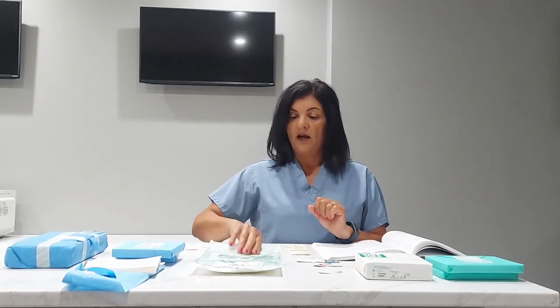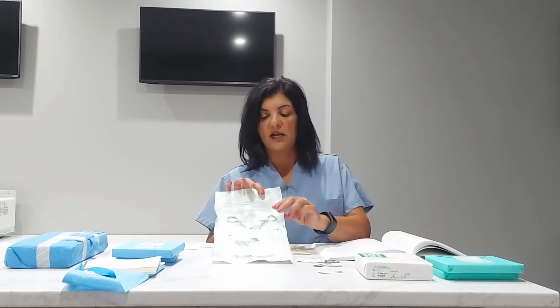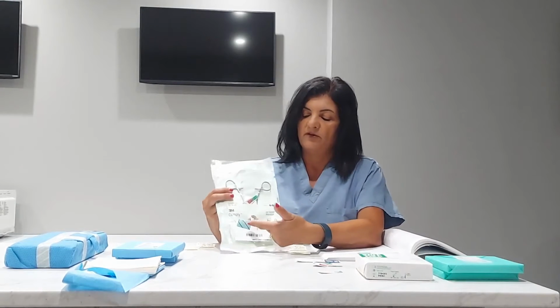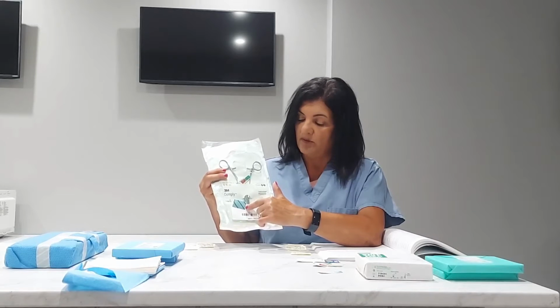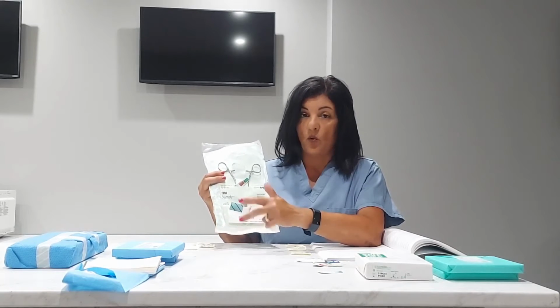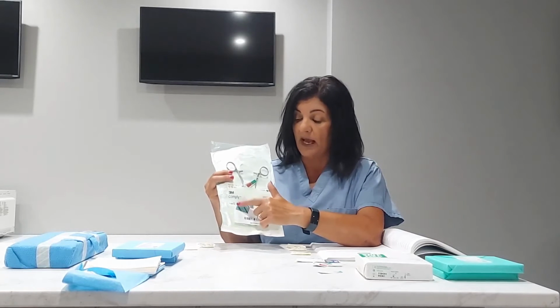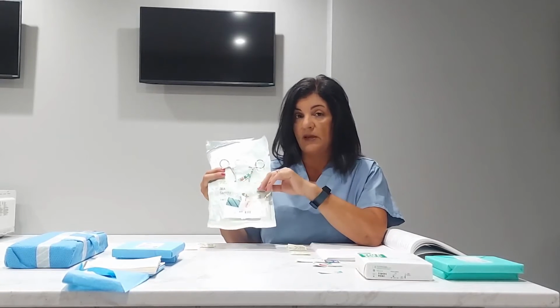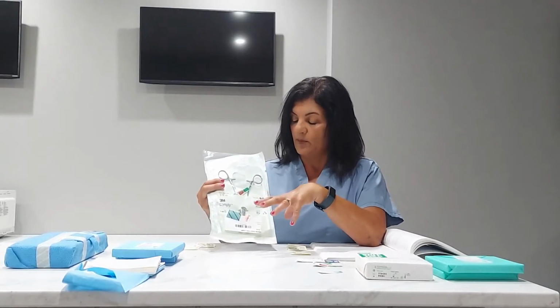I have an example here of a peel pack that has been sterilized. Just to give you an example, my first visual is that this tape has been exposed to one of the three parameters because these lines were cream colored and they are now black. That tells me that this package has at the very least been exposed to heat or temperature.